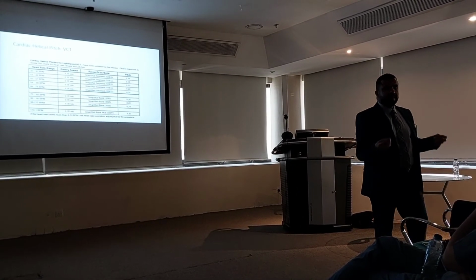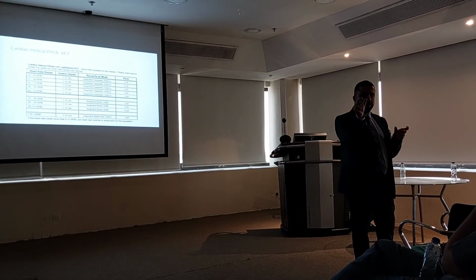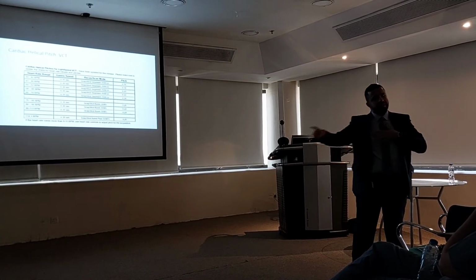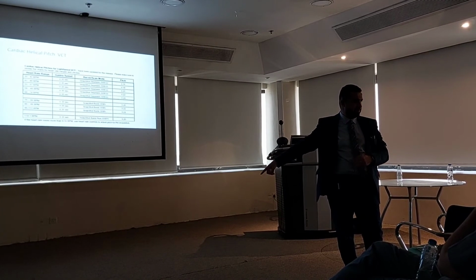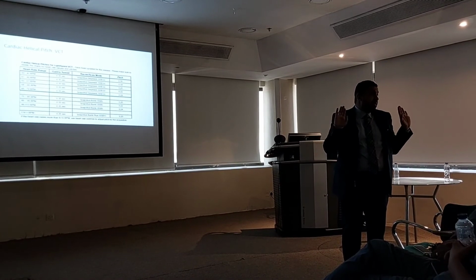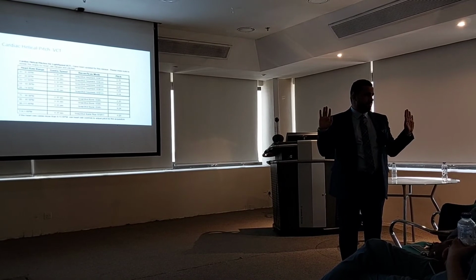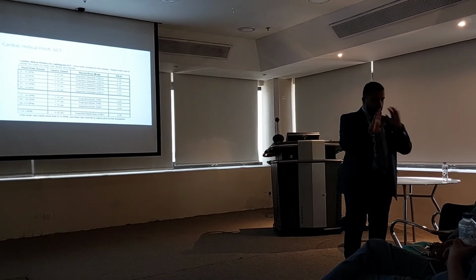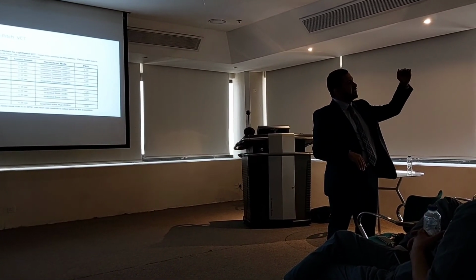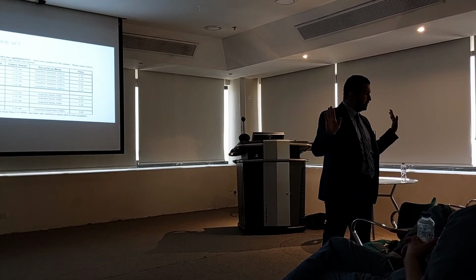You get that? So now it decides the good pitch for that heart rate when the patient is holding his breath, which is the situation in which the scan will be done, in the middle position. Even if the heart rate returns to normal, it's fine. By the moment I click confirm, it will check and decide. Yes, confirm goes to move to table. I will do this: my dear patient, take a breath and hold. I'm looking at the heart rate. 70. Confirm. Breathe normally, thank you. Move it.